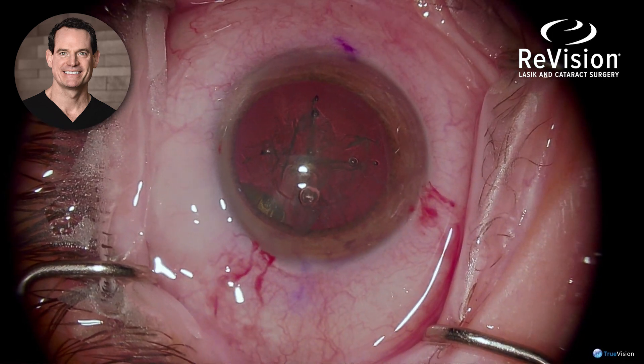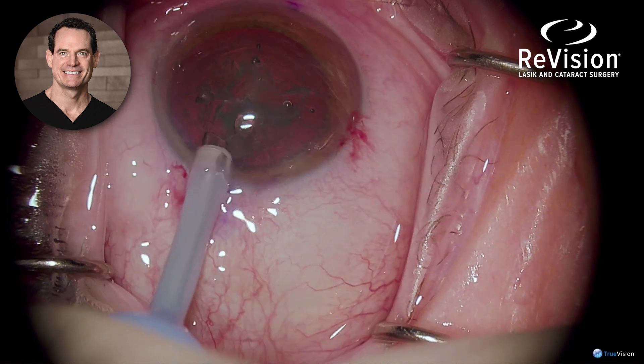This is subconjunctival lidocaine for numbing, for the later injection at the end of the case.